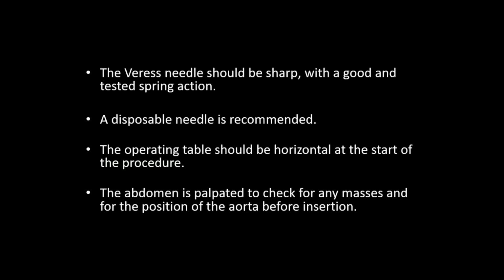The contraindications, by the way, for a Palmer's point entry, are for those patients who had a history of left hypochondrial area previous surgeries, like splenectomy, or a previous splenic hematoma evacuation, because of expected possible adhesions at the same point.